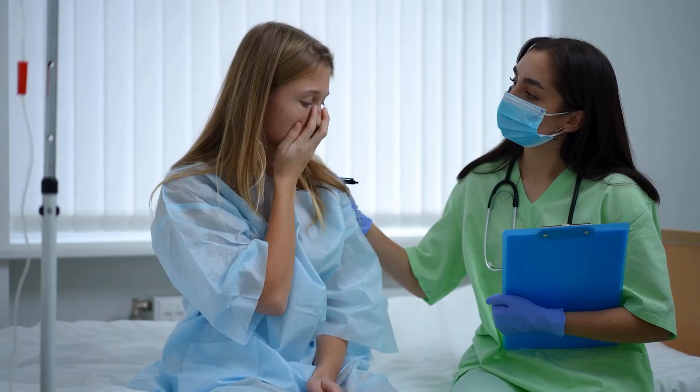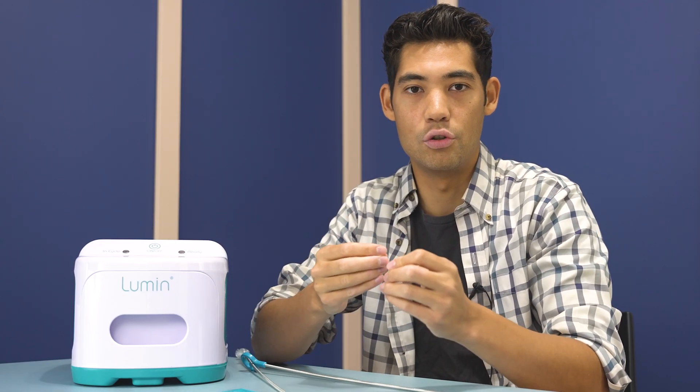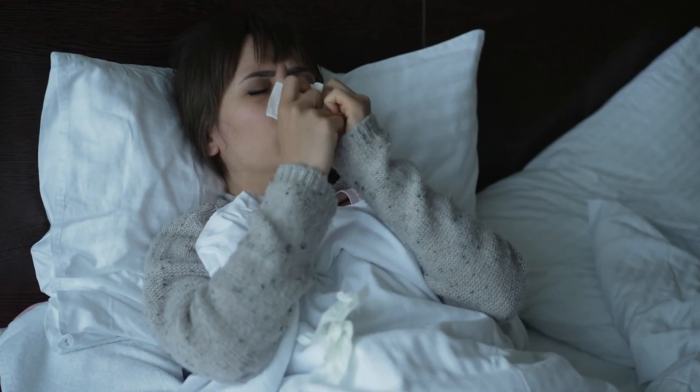What happens when you don't wash your CPAP machine? Well, you get sick. A lot of people confuse getting sick with the common cold or COVID-19 — where someone who's sick gives you a pathogen you wouldn't normally have. But a high level of bacteria, such as the bacteria found in biofilm just from water, will also get you sick. A high level of bacteria is going to overwhelm your immune system, and you're going to have things like a sore throat, possibly a full-blown fever — anything your body does as an immune response to get rid of that bacteria. You can actually make yourself quite sick, even without contact with anyone, just by not washing your CPAP regularly and allowing bacteria to build up.